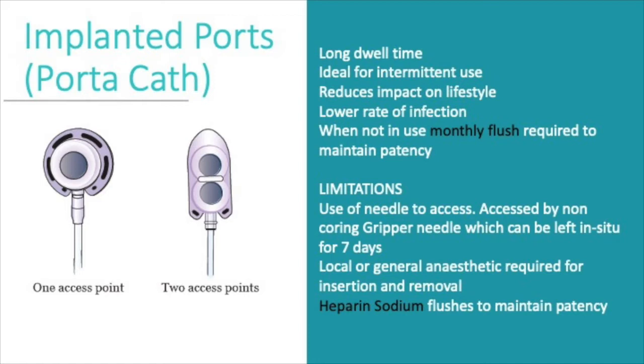Implanted ports can be lifelong. They could have it all their life if they needed to, as long as it is looked after. We have had quite a few patients with it on their chest. We have had one underneath the patient's arm as well.